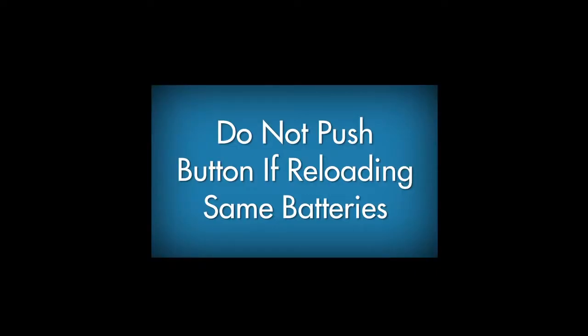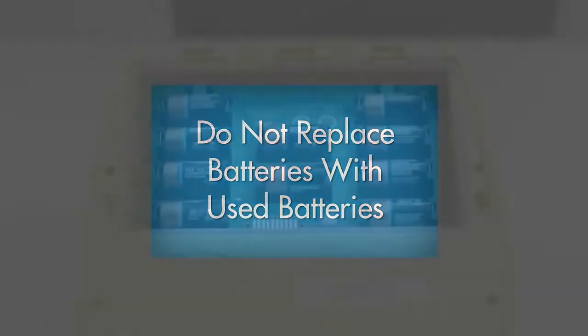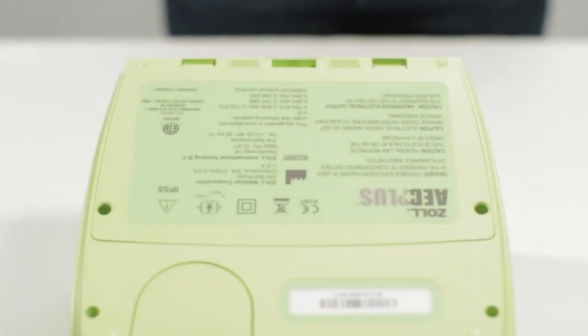Note that if you ever remove your batteries and then later reload them back into the AED Plus, you should not push the button. Do this only when the batteries are in fact new. Never replace the batteries in the battery compartment with used batteries. Close the battery compartment by inserting the cover at the top and snapping it back into place.